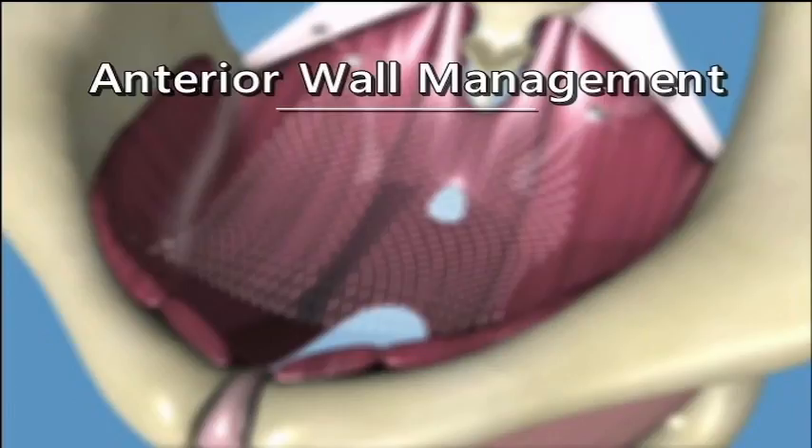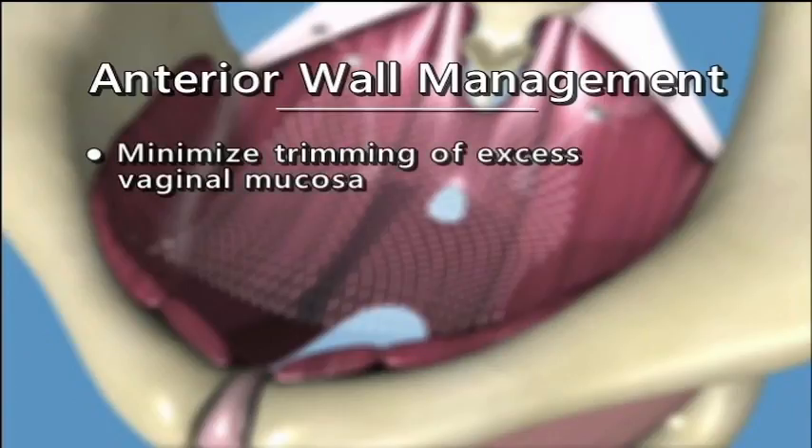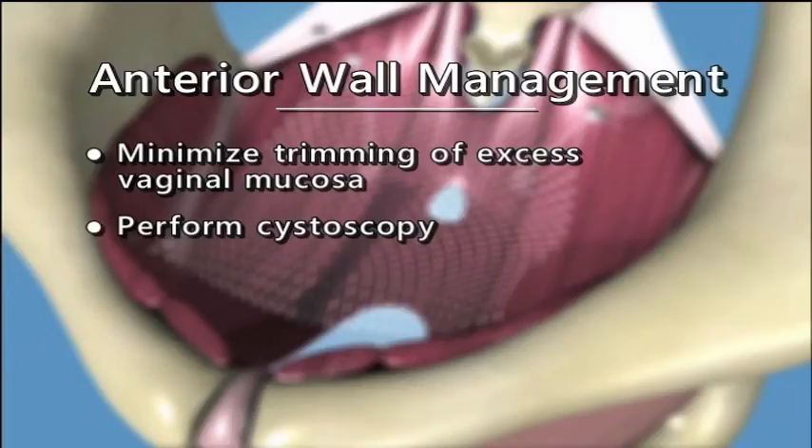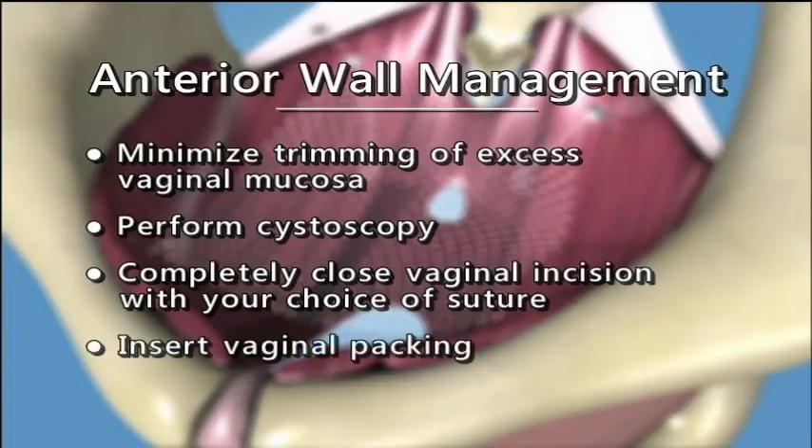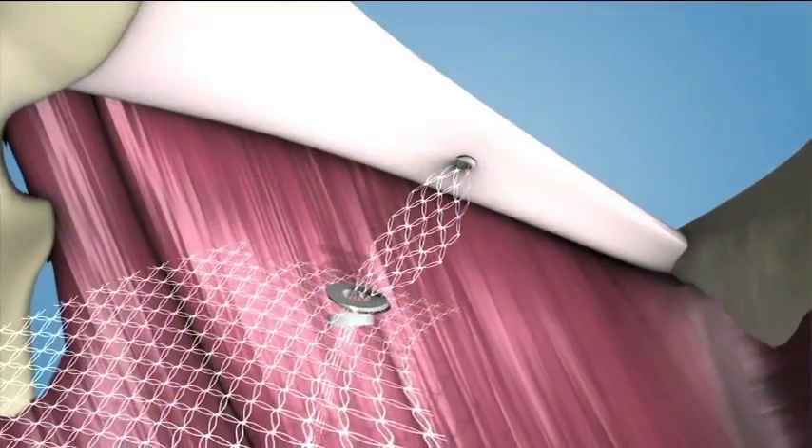Anterior Wall Management. Minimize trimming of excess vaginal mucosa. Perform cystoscopy. Completely close the vaginal incision with your choice of suture. Insert vaginal packing.